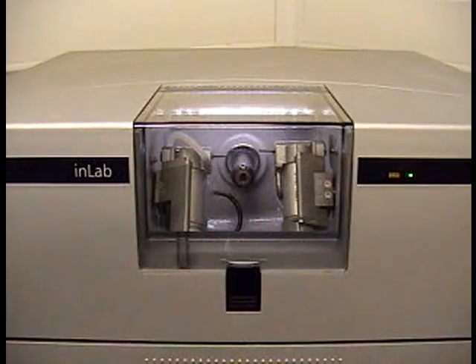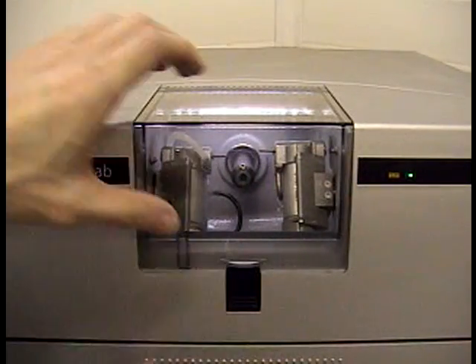This is stage seven: milling and glass infiltration of the coping that you designed on the CEREC software.